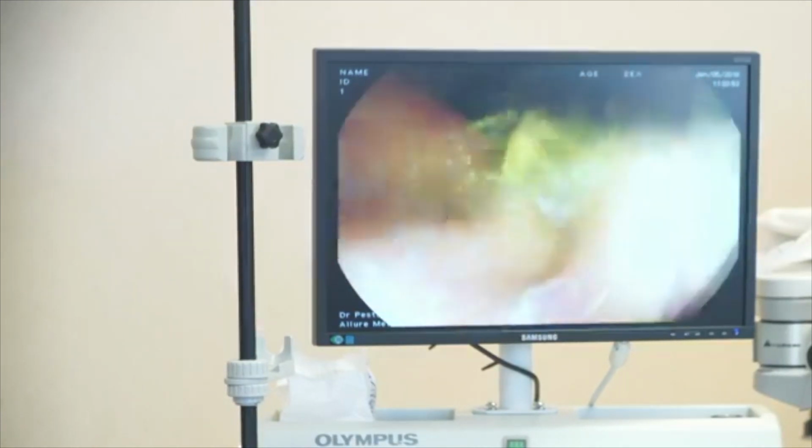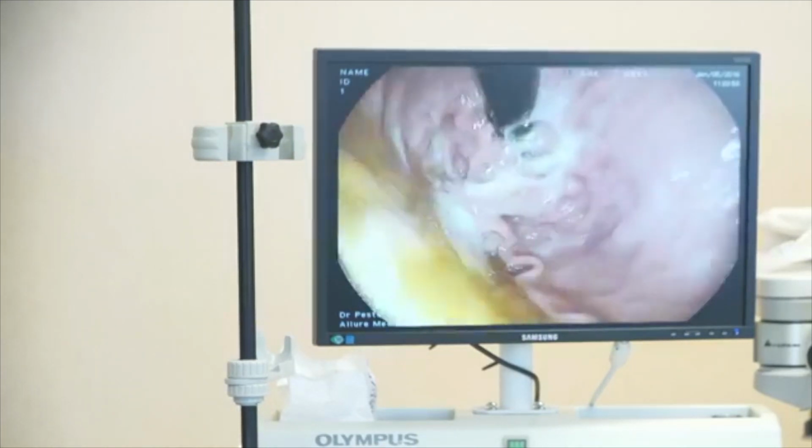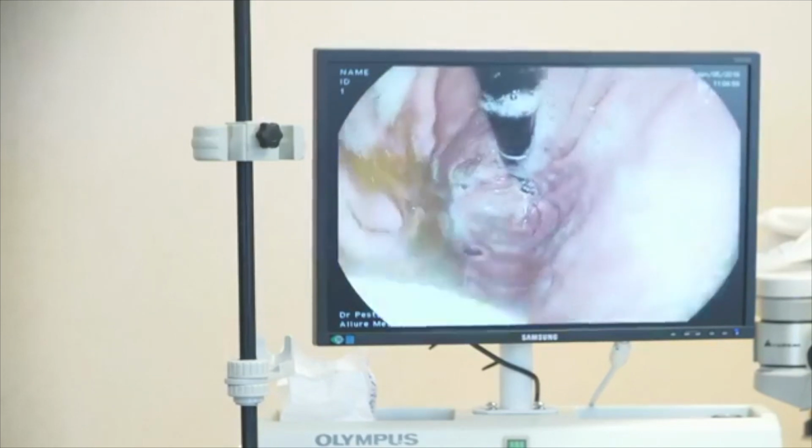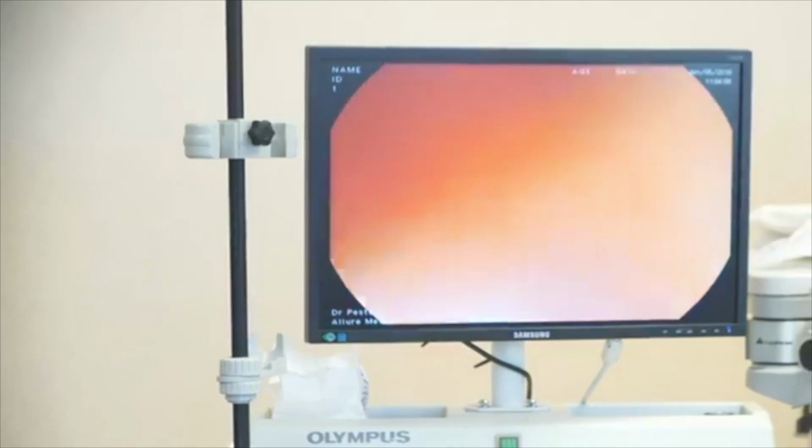Now we're looking inside of the stomach. You can see on the monitor that we're looking back onto the scope itself. So we just check out the entire stomach, make sure everything looks okay. And it looks great. So at this point, we're going to insert the balloon.